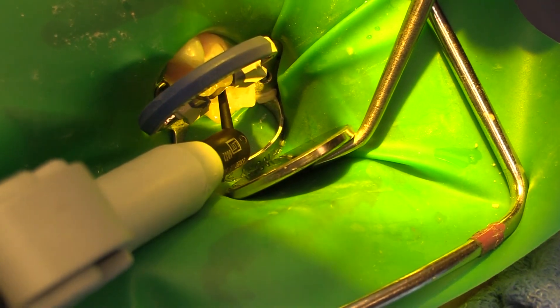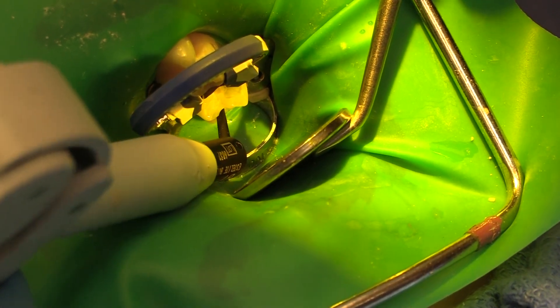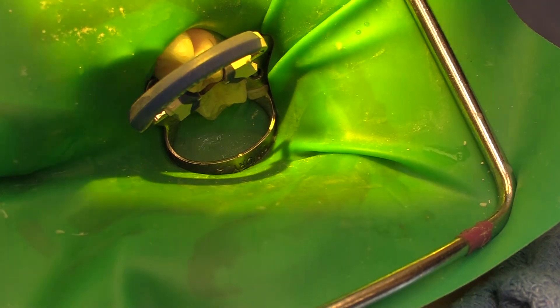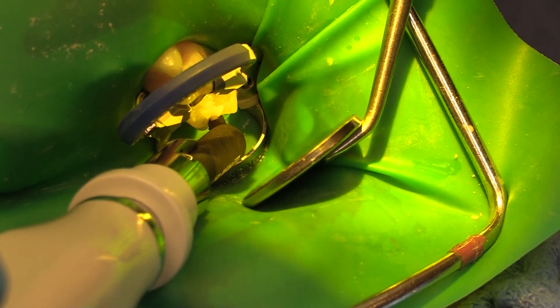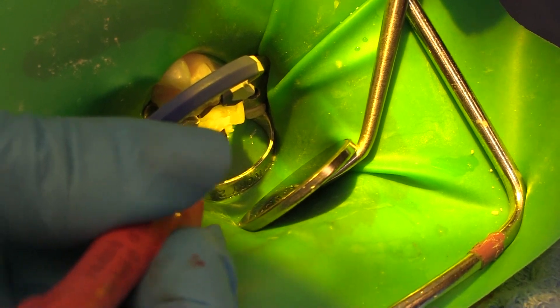This is our flowable. In this case I'm using an Estelite — it's a Tokuyama product — right down to the base of my preparation. Just a thin layer, about a 10% fill; this is going to act like caulking and fill in all the voids. And this is our Omni Chroma again by Tokuyama — it's been in a composite warmer so it's nice and workable. This is a universal shade, so it's going to blend and take on the shade of the tooth itself. We don't have to worry about shade matching at all.